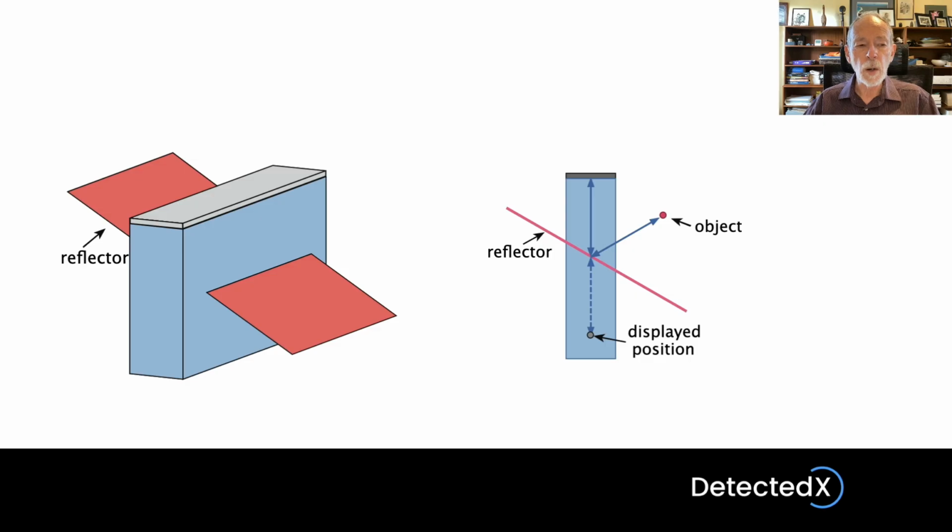So this is the more common situation, where you can see a mirror image artifact, and you then have to move the scan plane backwards and forwards to identify where it's coming from. Let me show you an example.